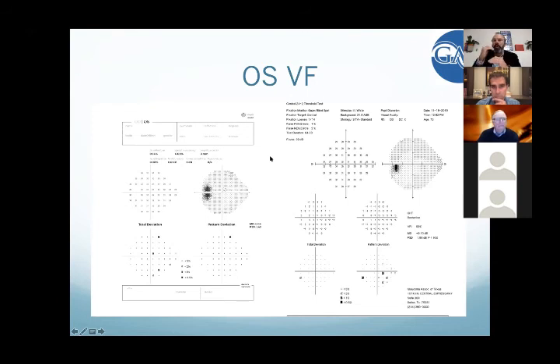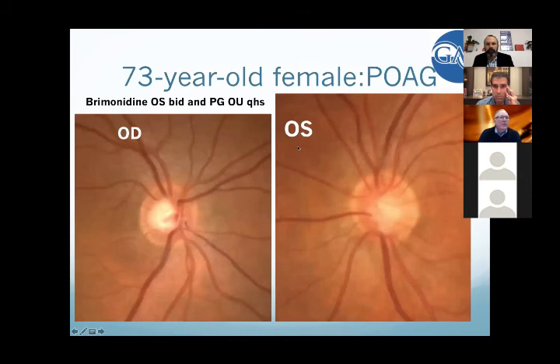Okay. So we're putting more emphasis on the detection of false positives rather than false negatives. Well, that's good to hear, because we all know if the false positives are high and the patient is button happy, you can miss a scotoma big time. And the false negative is less understood as to what it really means. So I'm glad to hear that. But again, those are all the things that are available to look at, and you should be looking at. Okay, I think we have maybe one more here.